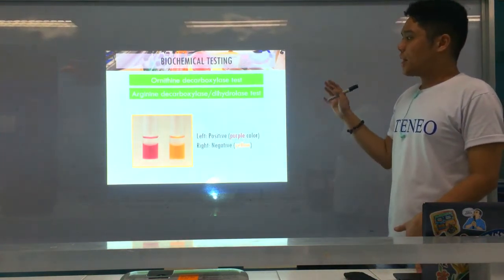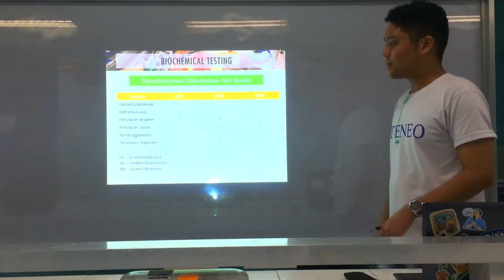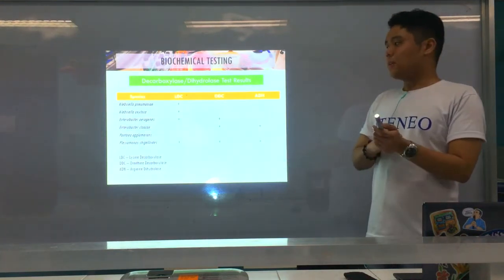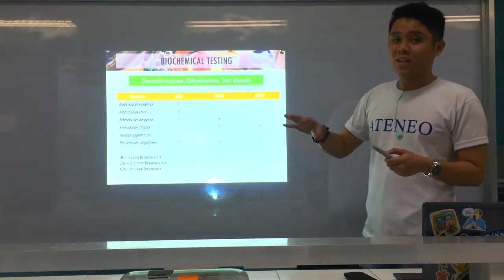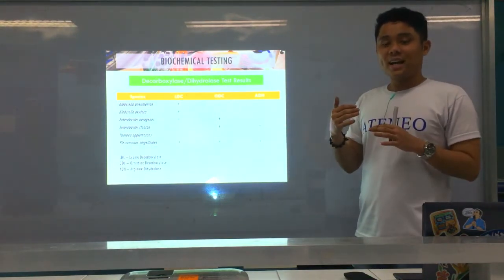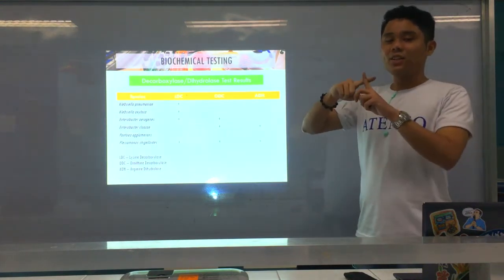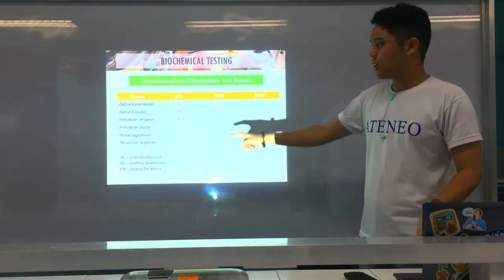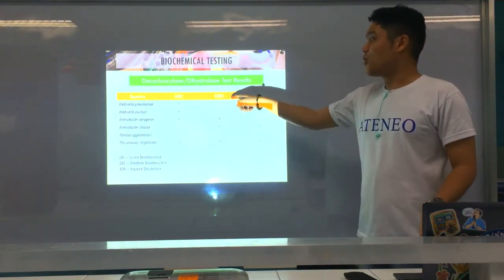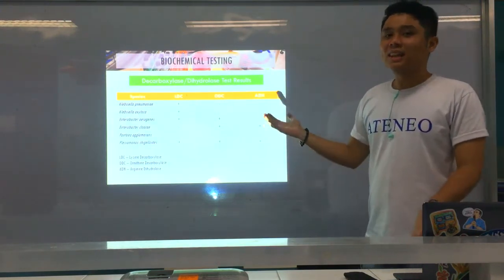Now, for the next slide, I will tell you, or like asa siya magamit. Example for some organisms lang that could really differentiate them from each other. So number 1 is Klebsiella pneumoniae and Klebsiella oxytoca. Di ba remember, unsa na test ang maka-identify ra gud nila? It's indole. Kinsa indole positive? Oxytoca, na letter T, so positive siya. Indole positive. Now, as you can see, medyo same sila, di ba? Same sila, result ra pud sa LIA. LIA na siya, LDC, ODC, and ADH. So, wala siya pulos na test po usually.